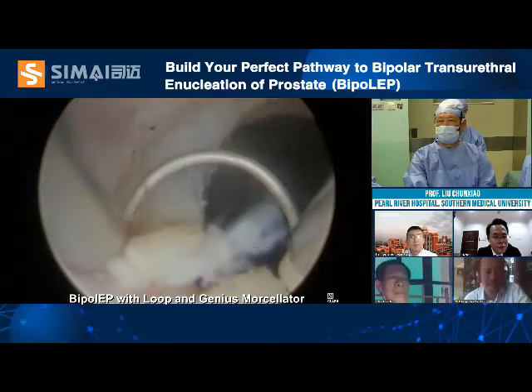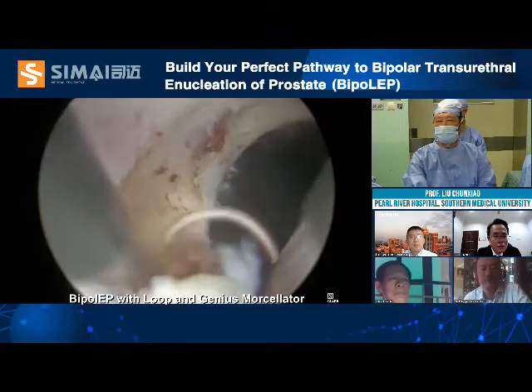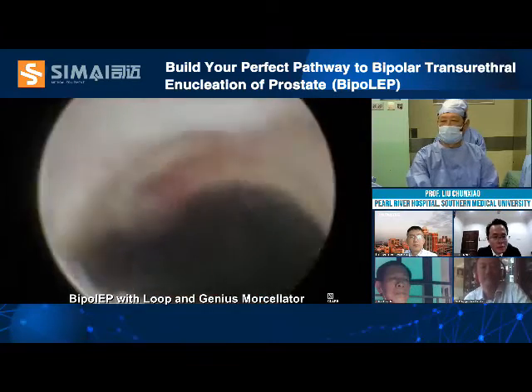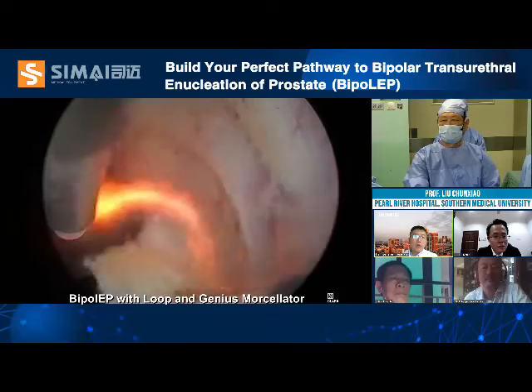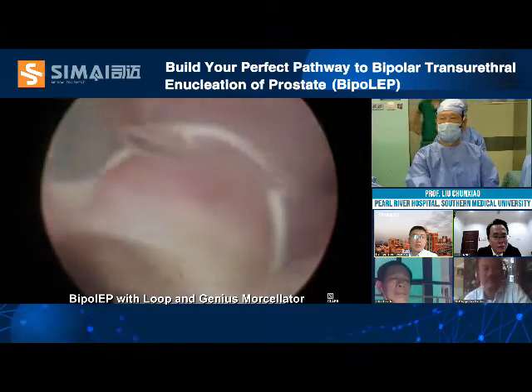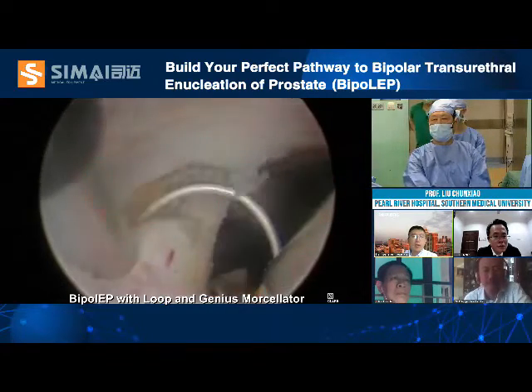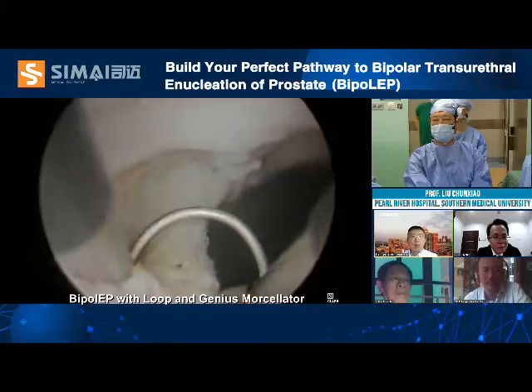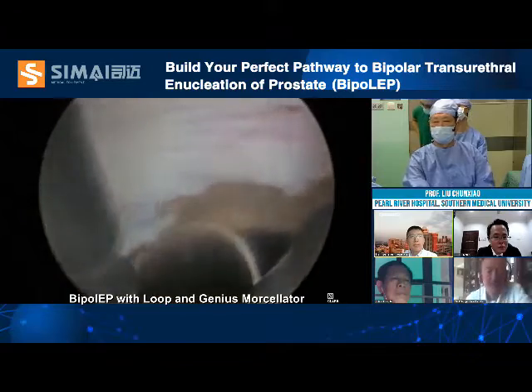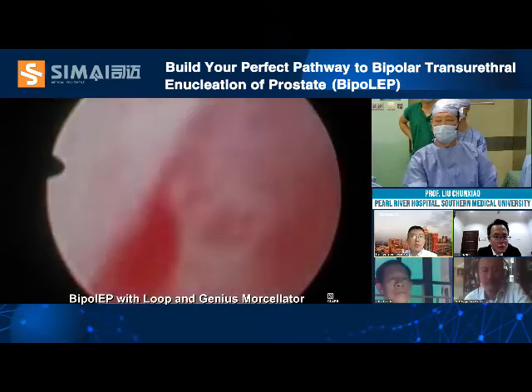So that's very safe, and we can reduce the mistake. See here — some tips on how to be sure where is the 12 o'clock, where is the bladder neck. He comes back to the urethral lumen and makes a superficial incision to add to the bladder neck, then comes back again. And now it is very easy to find the bladder neck.